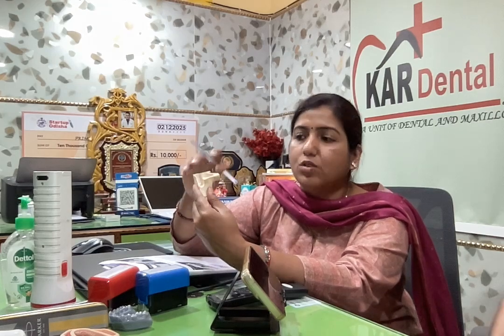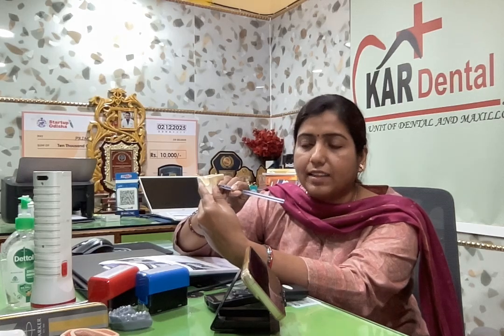So once we try to place the TADs, I told you how to place them: what is the first angulation with which we need to insert it, and then how gradually we need to take it towards the tooth and place the TAD. There is a minor difficulty during placing the TAD. As we know, the zygoma is a curved bone, and during the placement of the TAD, we need to appropriately locate the infrazygomatic crest, where we need to first put the implant screw tip at 90 degrees and gradually incline it towards the tooth and then insert it.